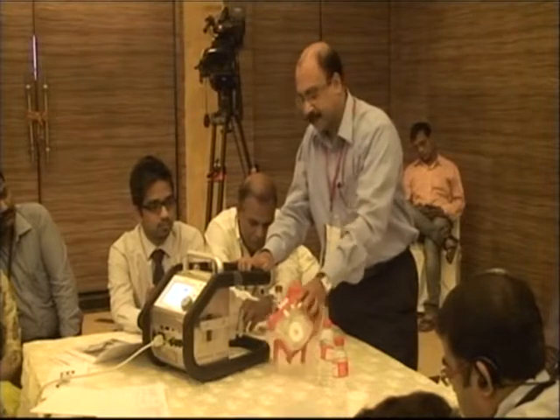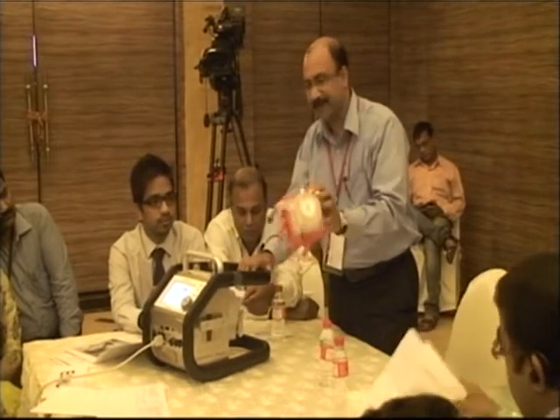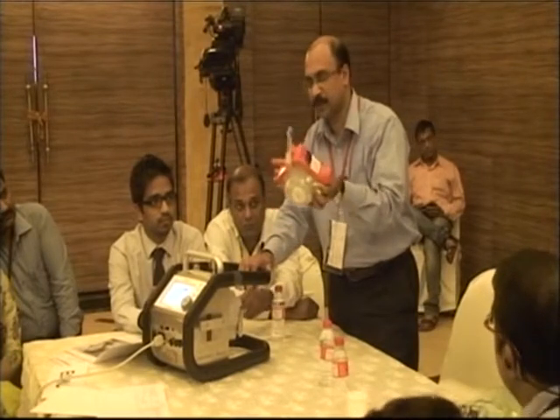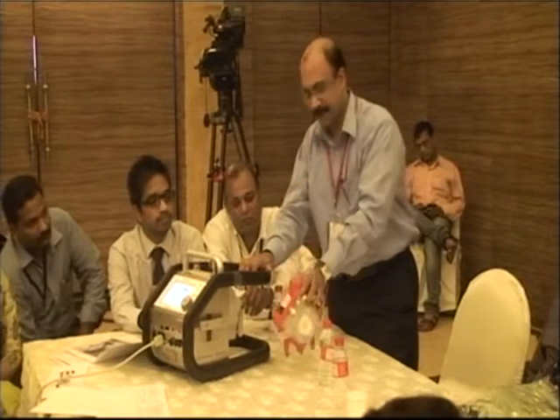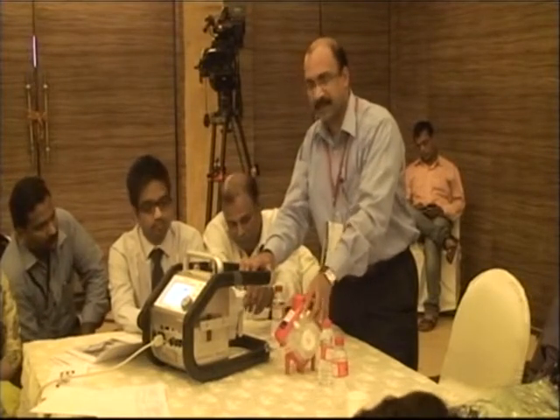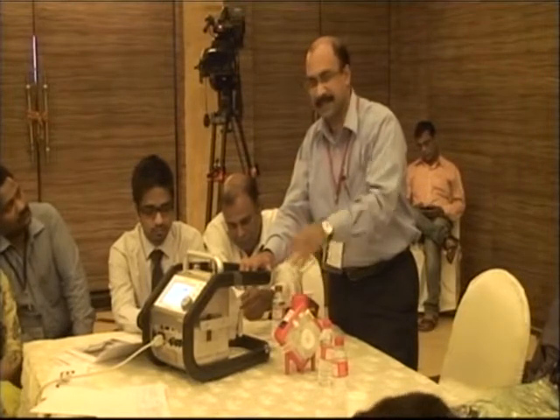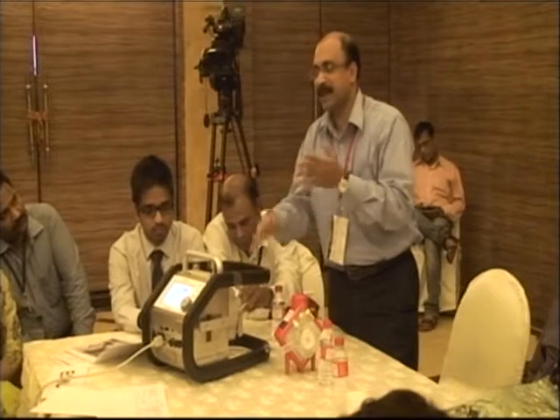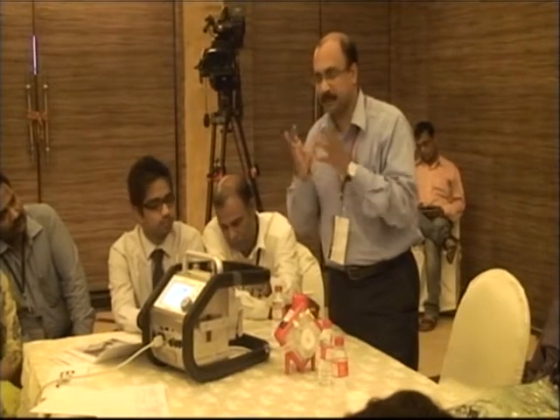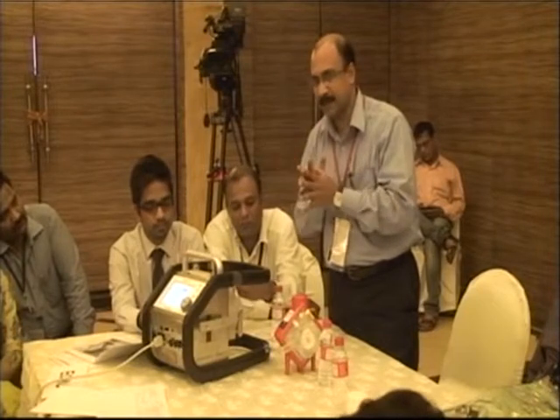And Sandeep is going to discuss the technical part of it. As you know, this can last 30 days, so we can in fact continue the patient on the ECMO machine for 30 days. There are complications associated with the ECMO machine, like bleeding, infection and all those things which can set in as you leave the patient for a number of days on the ECMO machine, but that is the challenge. You need to try to stabilize and get it out as early as possible.